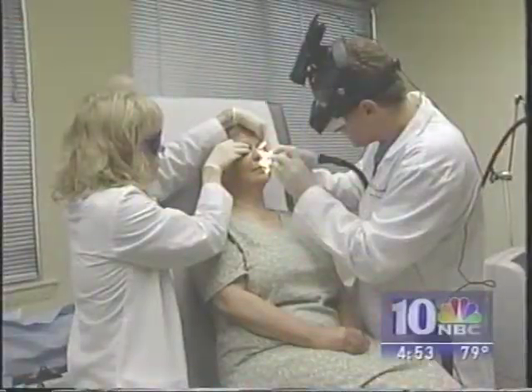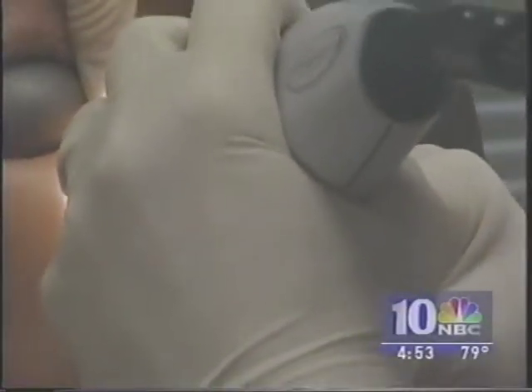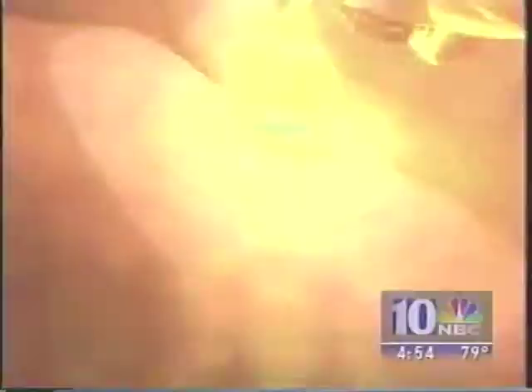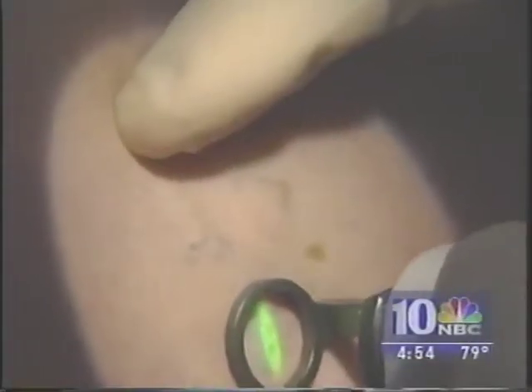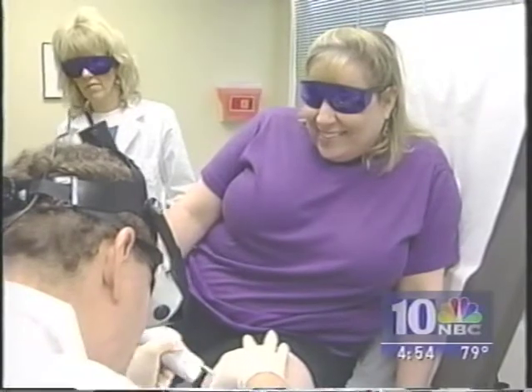Laser surgeon Dr. Eric Bernstein uses the Perfecta laser. 'When you're aiming at big targets, you need the laser to stay on a long time, and that's an extremely difficult thing to do that until recently couldn't really be accomplished.' The laser works by rapidly heating the vein and irritating it with light. Veins seem to disappear immediately. On facial veins, often they disappear and that's it — you're done. On leg veins, usually it takes two to four treatments to get the vein to go away.